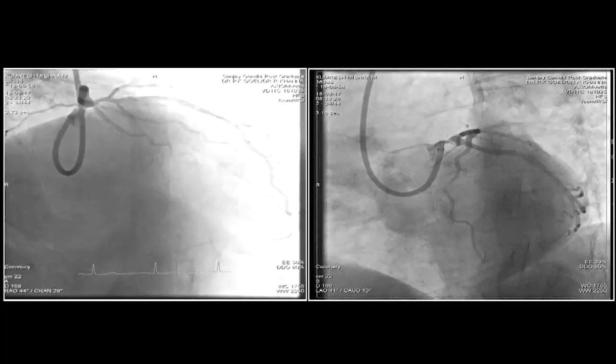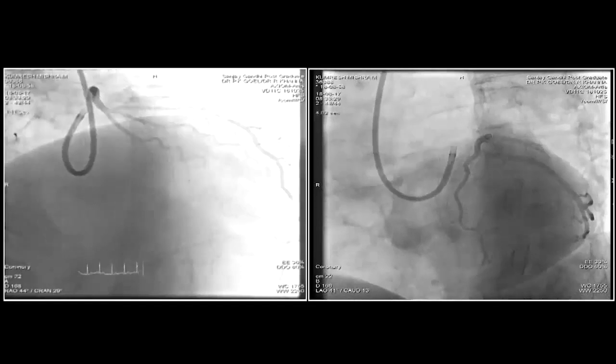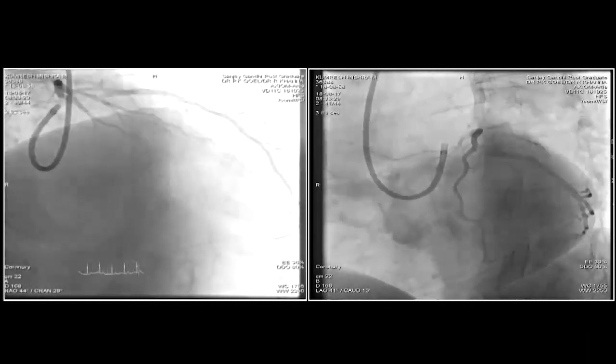Dr. Prasad, because of this biplane, I have a little limitation on the angle, so I have to compromise slightly. That is the reason. Otherwise, I could show you all. Sure, I hope you realize, because we're working on biplane. That is the downside of biplane, that you have some limitation of angle.